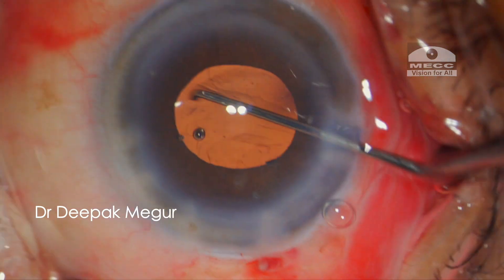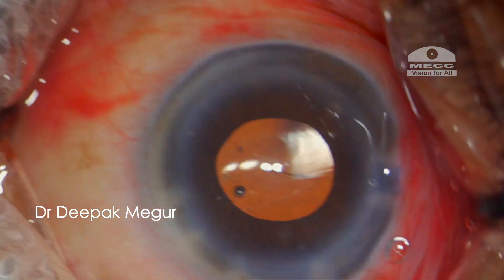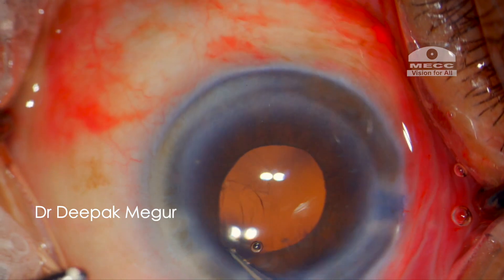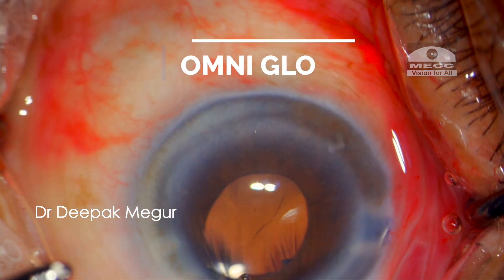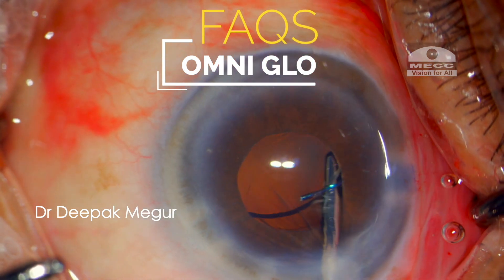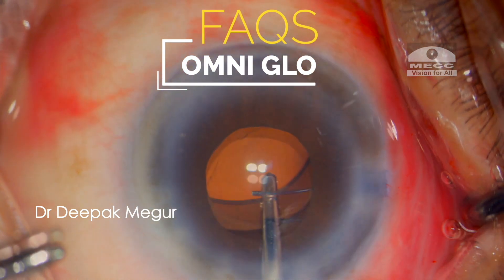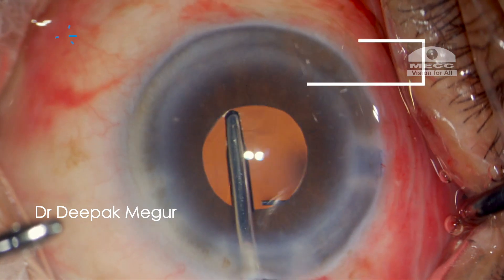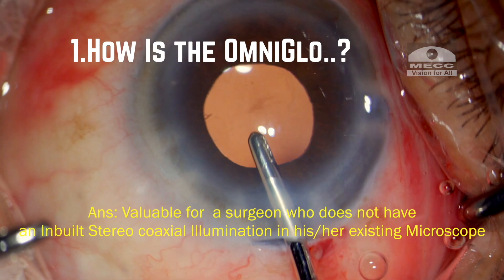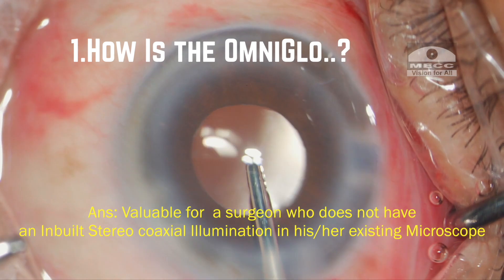There is no doubt that the stereo coaxial illumination system is of immense help in enhancing visibility during routine surgery and also safety during complex surgeries. Regarding the most frequently asked questions about this device — how is the Omniglow? For a surgeon who has not experienced stereo coaxial illumination, this would be wonderful. I think you will enjoy it.